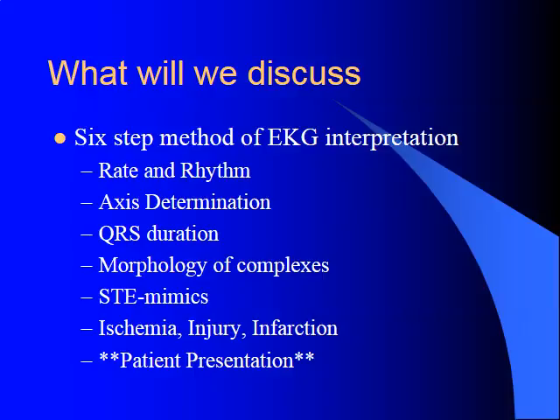Step number 7 down there is a rule that you should always correlate your findings on your EKG to patient presentation. If you remember, we talked about asystole. If you have asystole on the monitor, but your patient is sitting there talking to you, more than likely you don't really have asystole. You got a problem. So that's what patient presentation is really talking about, and you should always do that with all your EKGs.